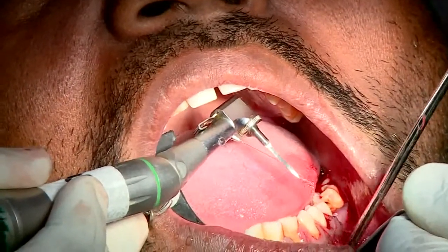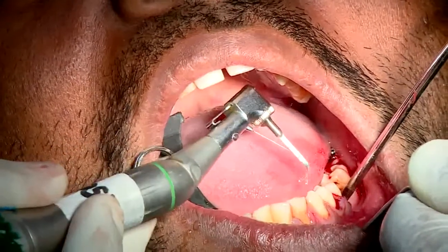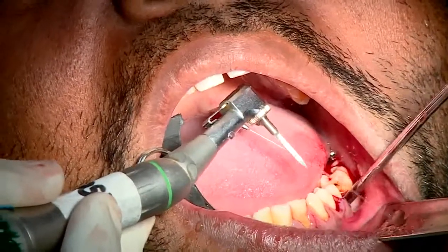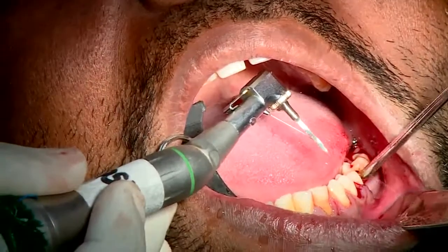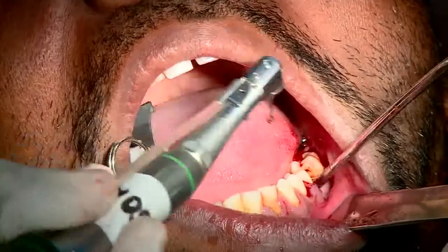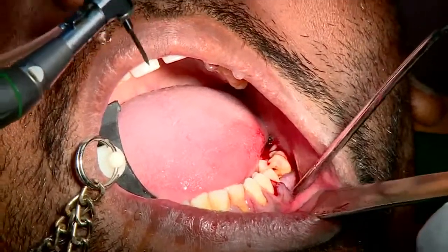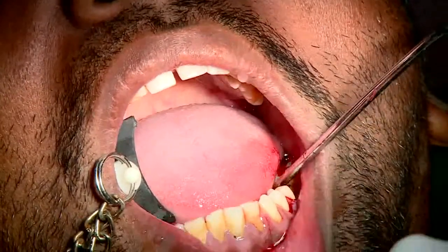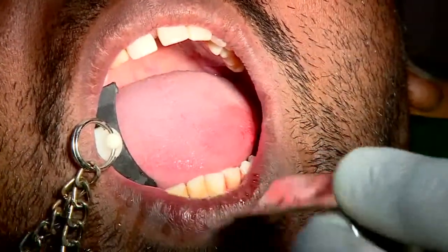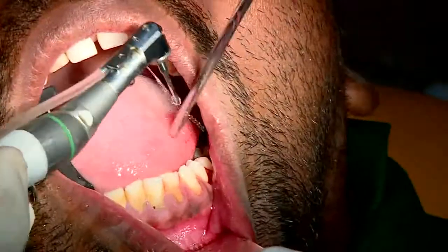We are talking about a cooled bur. The water comes and hits against the bur tip where it is actually drilling the bone. So that is one of the reasons why we are talking about that. These are cooled to select. Ideally we have to go in for what we call the low-speed option, which has much lesser heat.